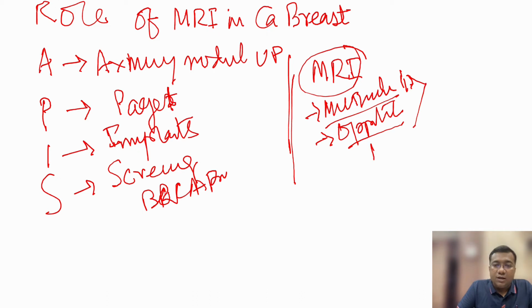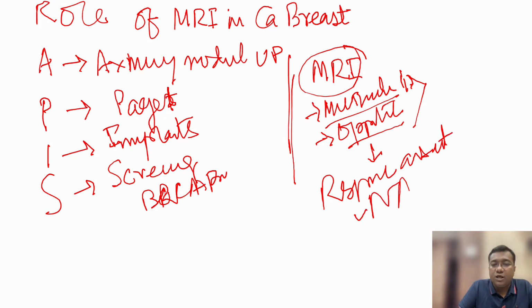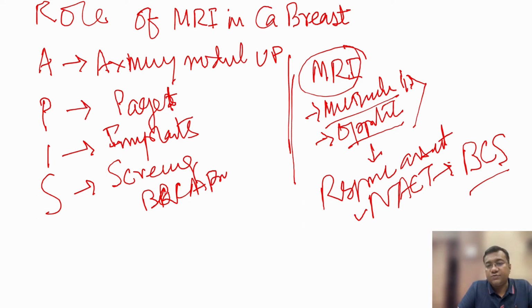Okay, not only that, response assessment, especially patients where you have planned for NACT followed by BCS. In these patients, response assessment and your assessment of the tumor shrinkage is very important. There comes the role of MRI.